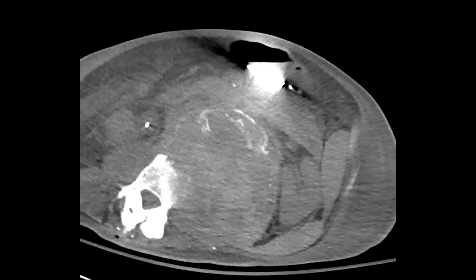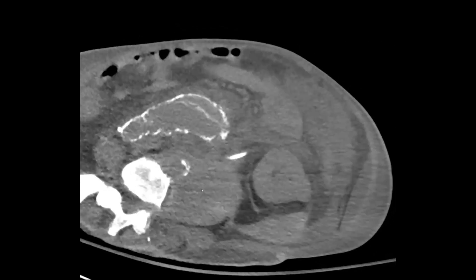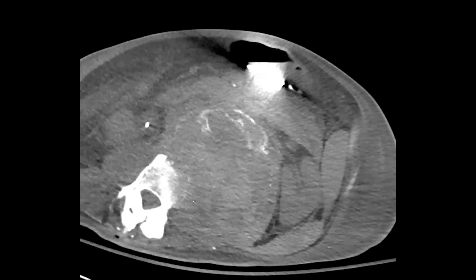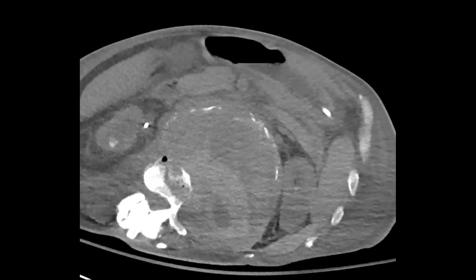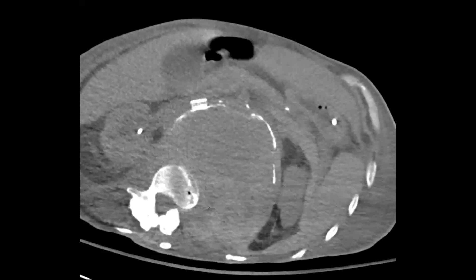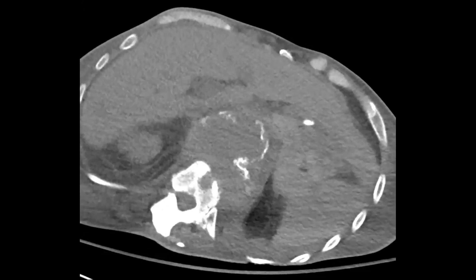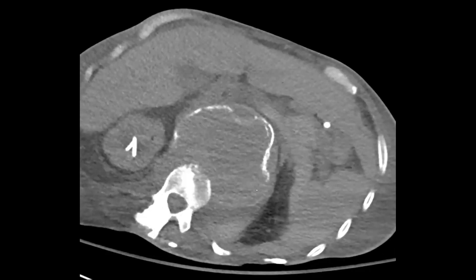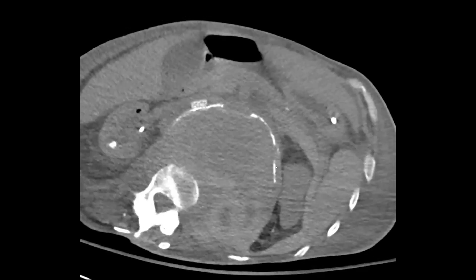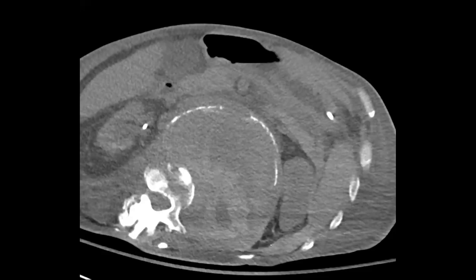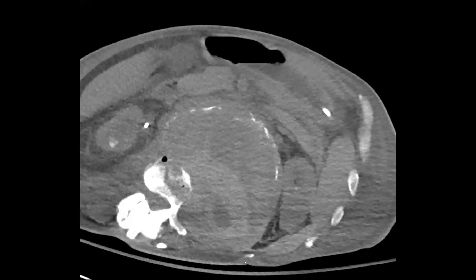Here we can see hyperdense blood going down into the pelvis. To me this was a good reminder — these plain films are often there for things like a feeding tube, and you're just looking at them, but if you have an AAA, the patient is at generally increased risk of rupture. If you can be the person who picks up that the calcifications have moved over time and are displaced, that is a sign of rupture.